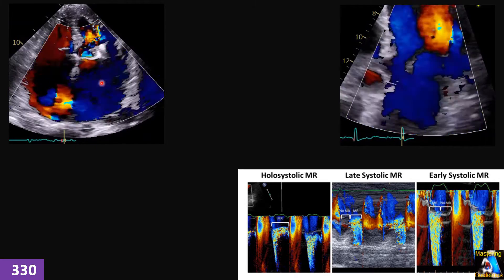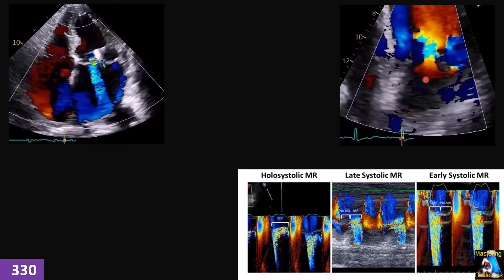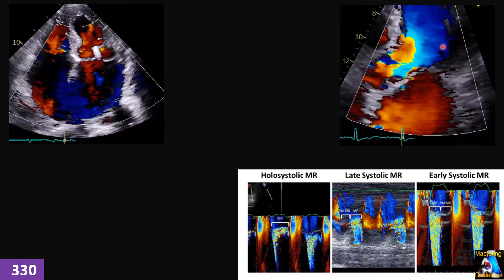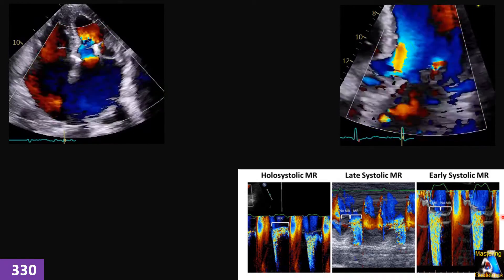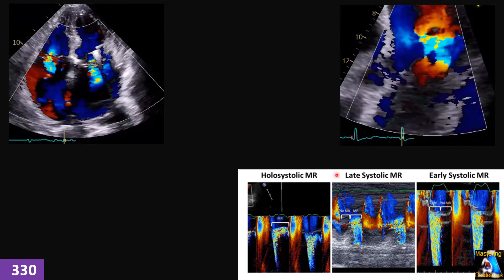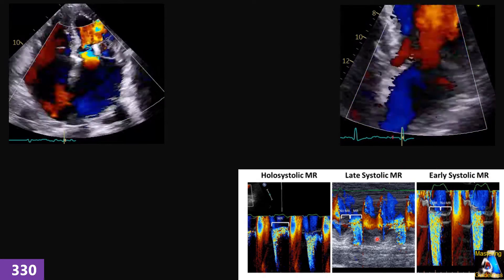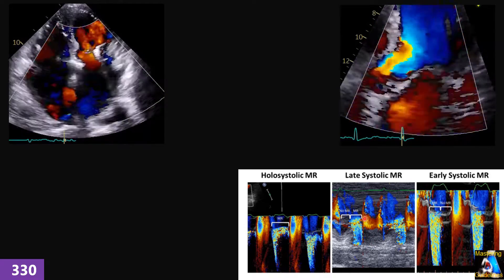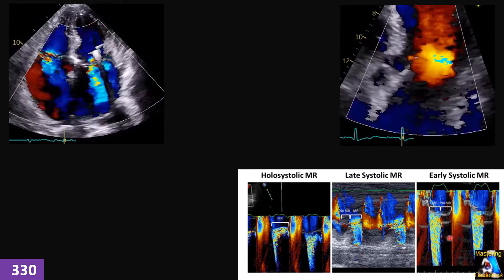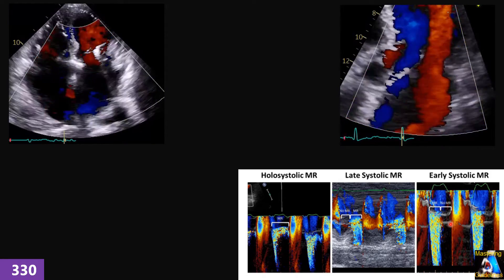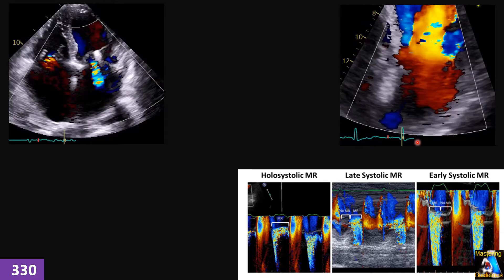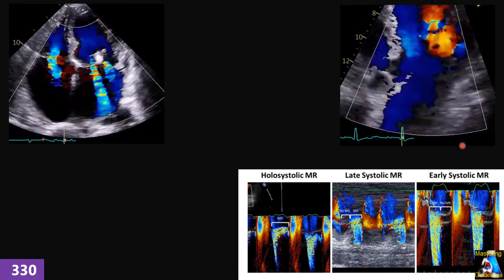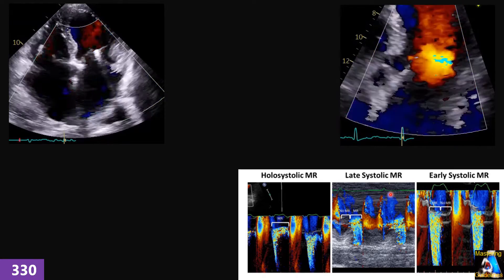...where we have multiple jets, or they are eccentric, and we don't see a very clear PISA — or in those cases where we have non-holosystolic regurgitation. For example, on this case you can see color M-mode on the mitral valve: this is mid-systolic to late-systolic regurgitation, or early systolic regurgitation.